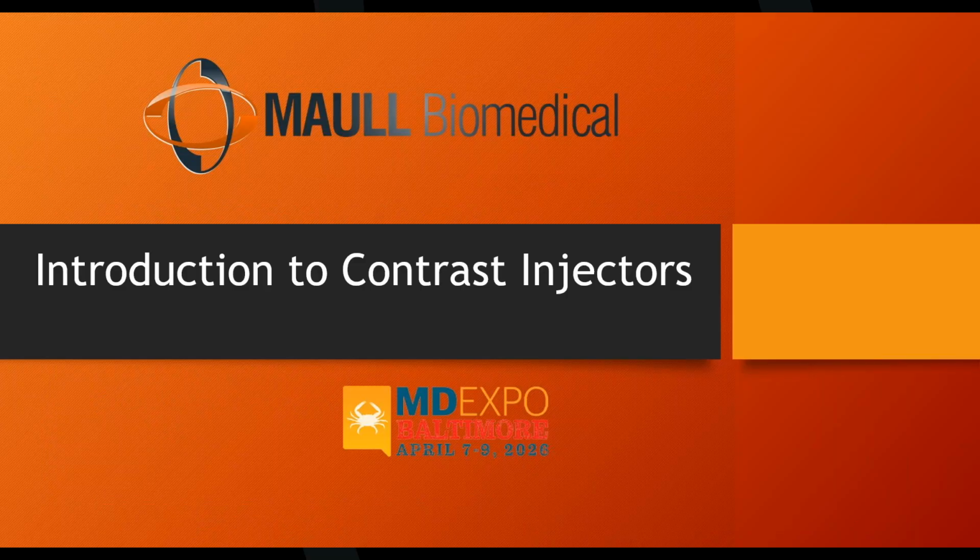All right. So what these machines are for is to help blood vessels show up on X-ray images. So before we get to that, I'm gonna cover how X-ray images are produced real quick. So just take your typical rad room. Typical what civilians think of as an X-ray room. Table, patient's on the table. There's an X-ray tube above the table that fires X-rays into the patient. And inside or underneath the table is some imaging capturing device that used to be film. Now it's a CR plate or a DR. Well, now I think it's primarily DR plates now, digital radiography.